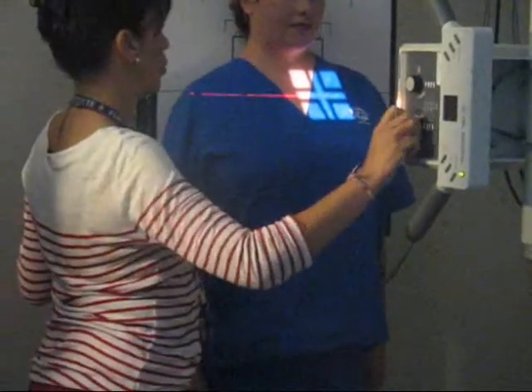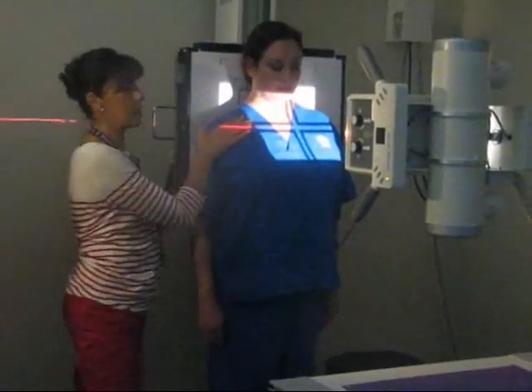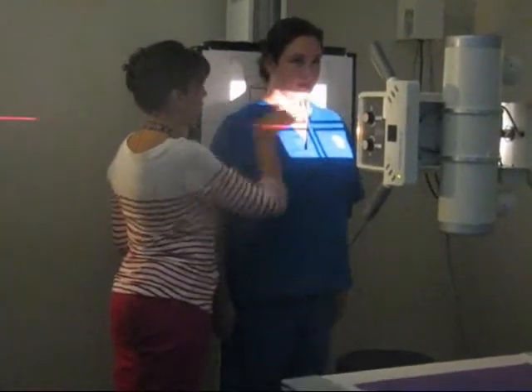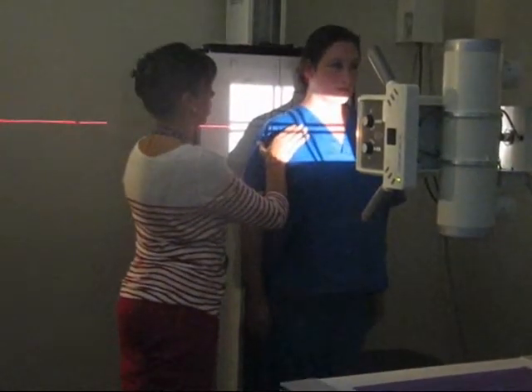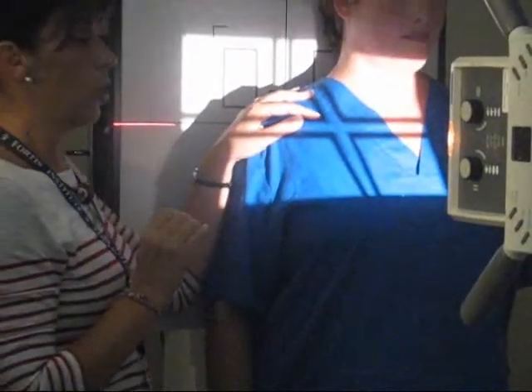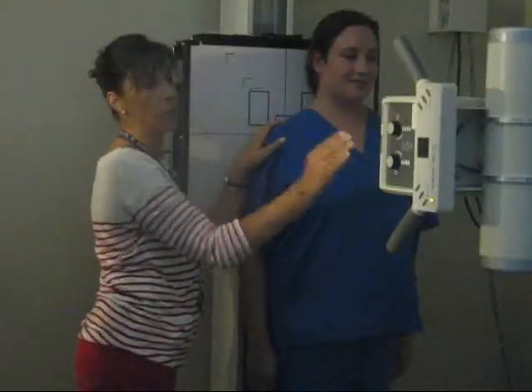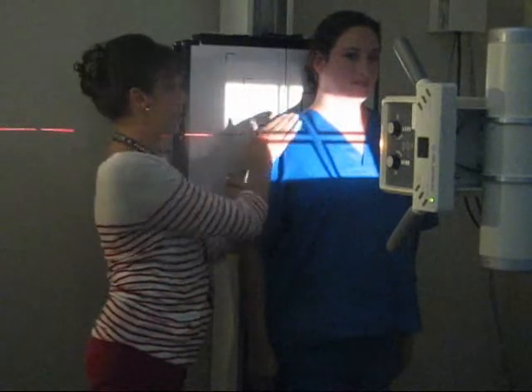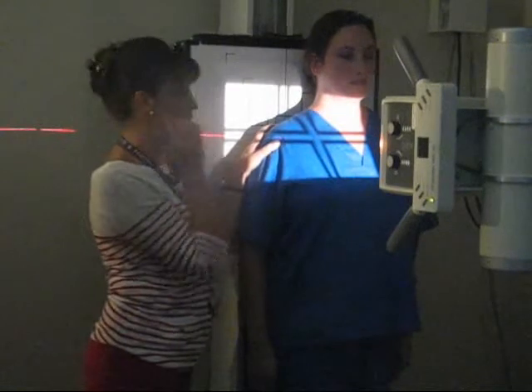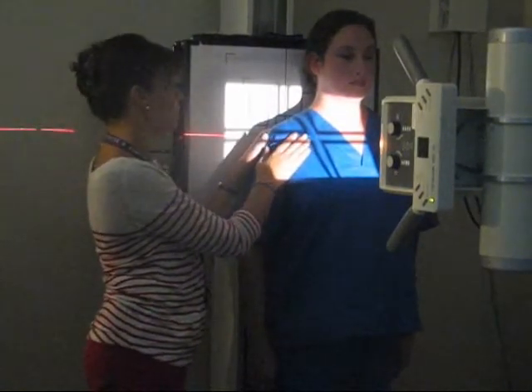And now you're going to position your patient for the correct shoulder. In this case, we're going to be doing the right shoulder. So we're going to ask our patient to slide that way a little. Very good. Okay. For the shoulder, of course, you would want the patient to remove the bra if it was a wound. So you definitely want to make sure that your patient doesn't have anything here. No bra, straps. Of course, she would be shielded, as we already said in the beginning of this film.